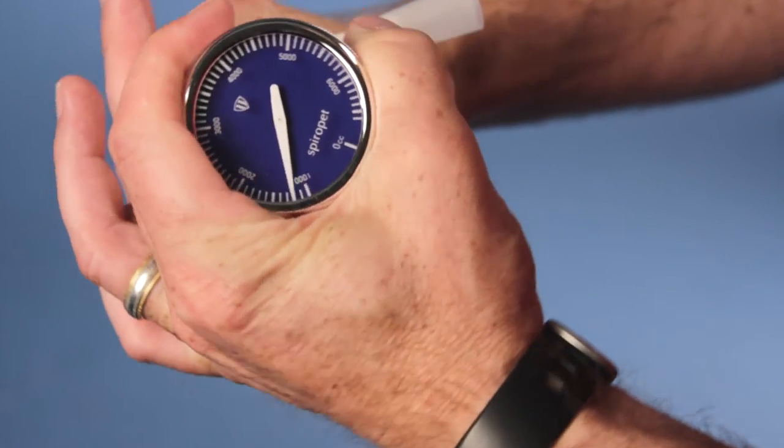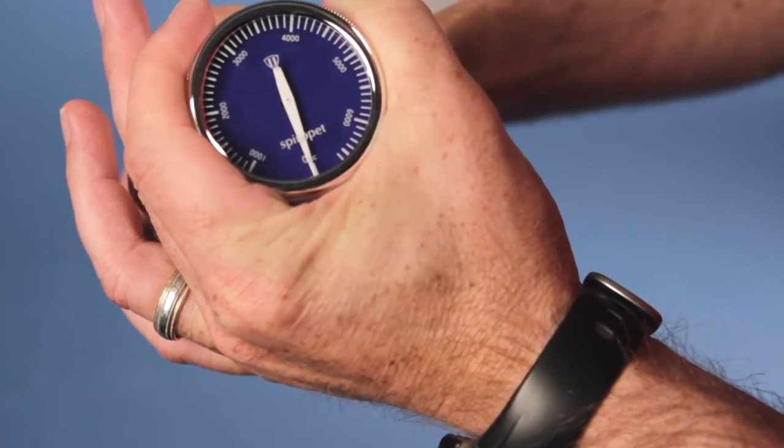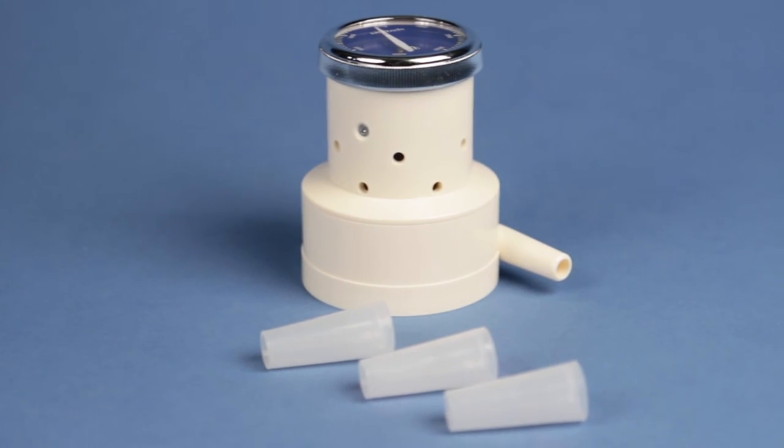Simply reset the device after each reading by rotating the dial. No special setup or calibration needed, the Dry Spirometer is easy to use, clean up, and store.